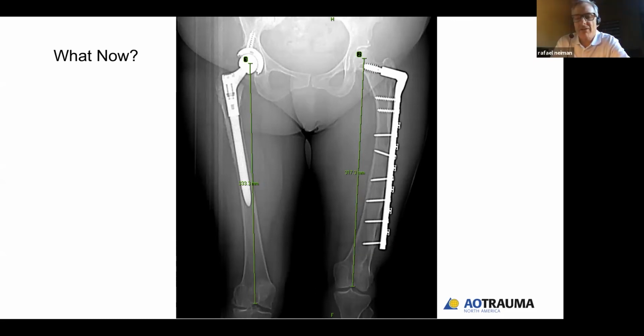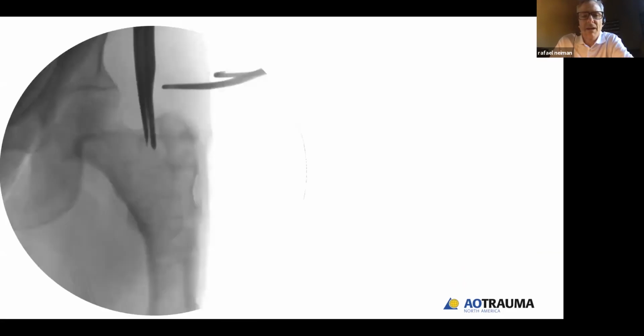Matt, you've talked about cavitation with some of the existing intramedullary implants when you're going to correct things. You can look down in her distal femur, and she may not have cavitation there in the usual sense, but she's definitely got some sort of abnormal bone there. So it's helpful to know where that is. I did decide to do a clamshell osteotomy on her, and what I'd like is for Matt to pick apart what's good and not good about this particular clamshell.